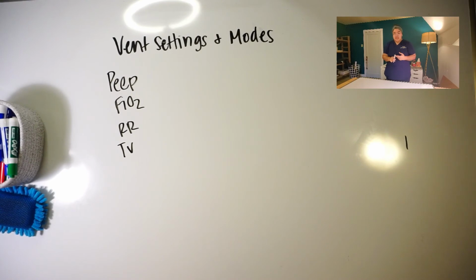If it's metabolically driven, you need to figure out what that other issue is that's going on first, or have an idea of what it is, because you're going to ultimately need to fix that. If this is respiratory driven, then we're already there, right? We're on the vent. Maybe we got pneumonia, something like that we need to fix. But if it's metabolically driven and we don't know what's wrong, then we got to figure it out.